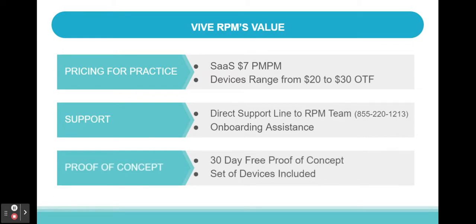To prove the efficacy of Vive RPM and to help integrate RPM into the workflow, we're offering a 30-day proof of concept with devices and software free of charge.